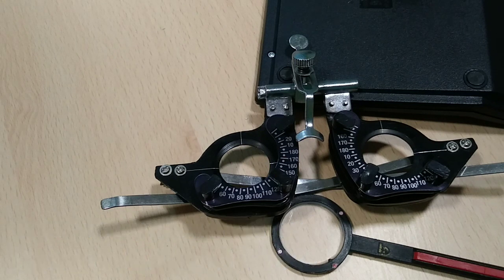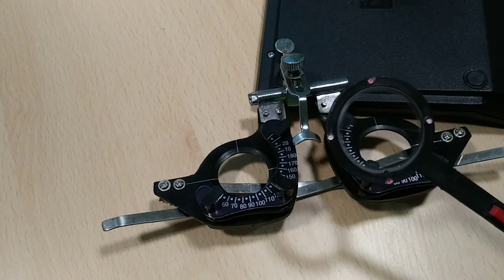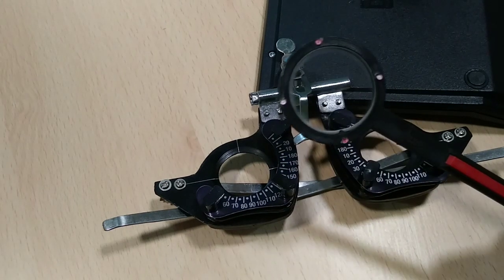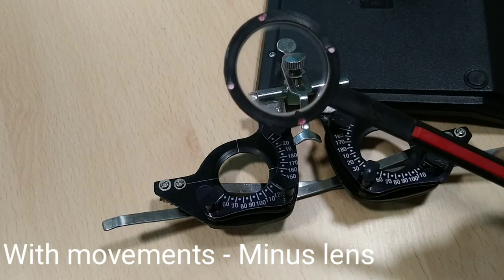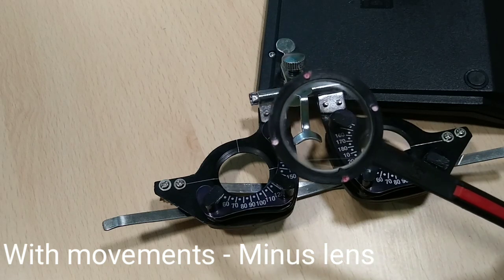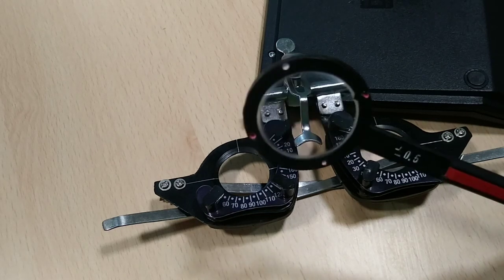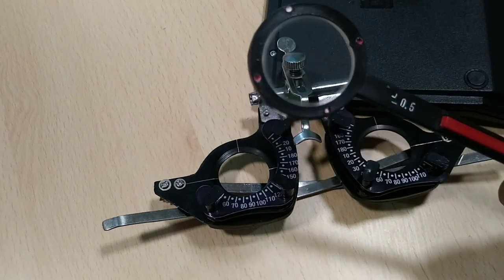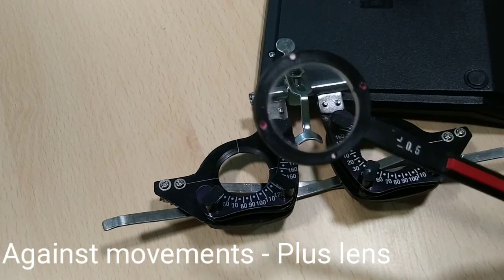JCC is a subjective test. To identify which side is plus or minus, we keep the white dot at 180 degrees and move vertically — up and down — and observe the movement. When moving, you can see it is moving with the motion, so this is the minus side. When reversed and moved again up and down, it moves in the opposite direction — this is the plus lens.